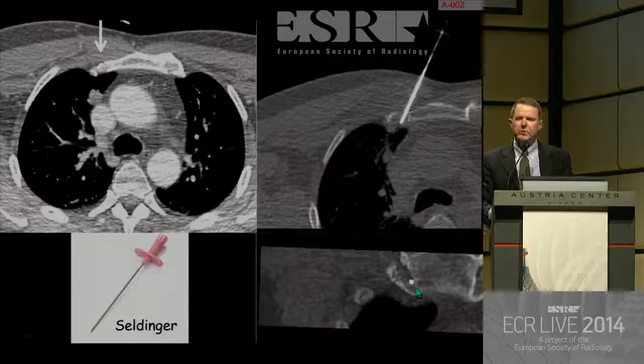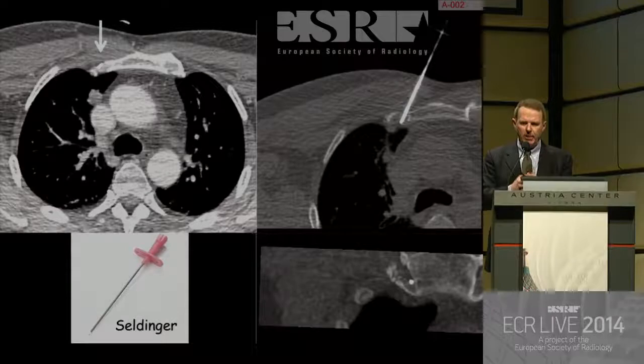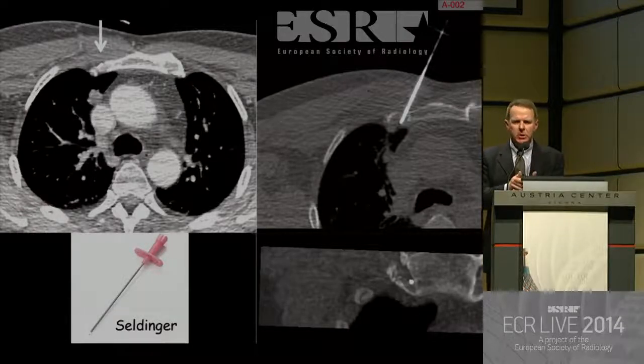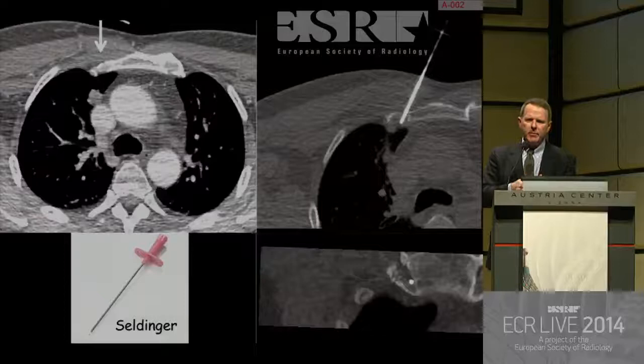And you see this is the coronal reconstruction of my pass, and you see exactly that I am in the joint. Of course, you give extra medication, extra anesthesia, and you ask the patient to collaborate because he will feel a very strong sensation. You know what is the most difficult thing? To stop once you have gone through the joint. Because once you go through a joint and you feel a lot of resistance, when the joint finishes, you are into the aorta. Okay? So you have to go very firm, but very step by step.